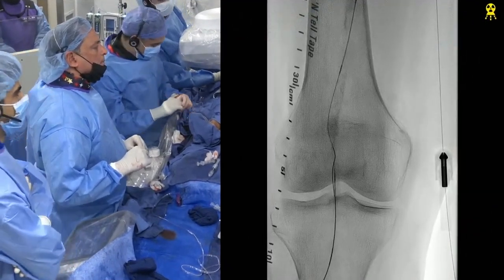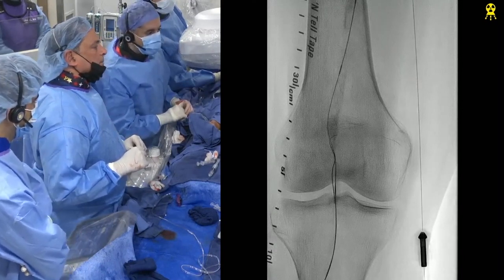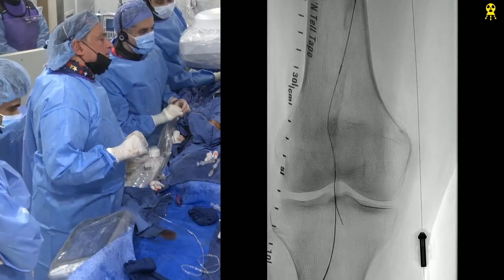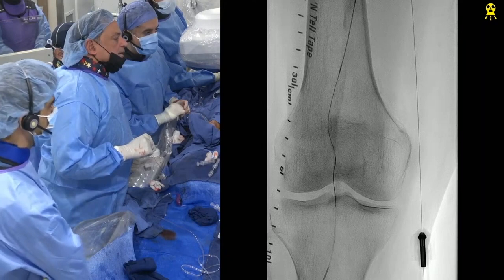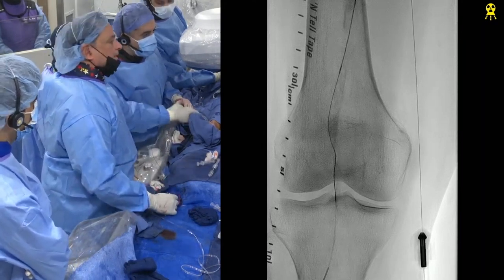Ray, can you give me a torquer on this wire? I think you should change the wire now. No, wait, PK. I think we're right there. Ray, can I get a torquer? I think you guys should change that wire. PK, you don't think the wire can get into your vessel? Are you not in the same plane, you think? Yeah, see, we're right there. There it goes. I don't know how close here. You have to change the wire. I know. Okay, I'm changing the wire.